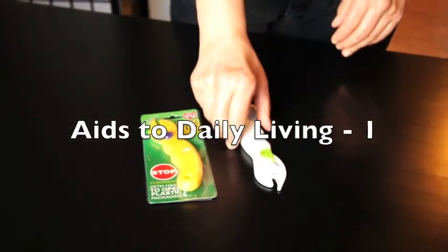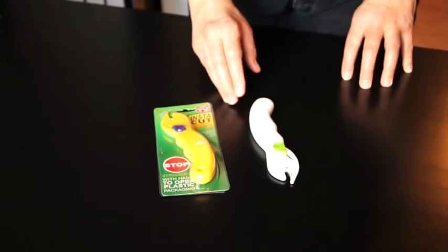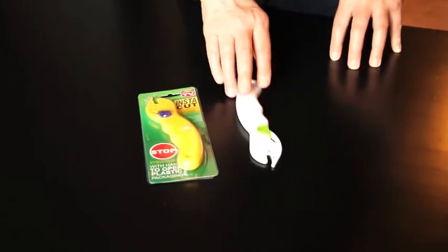Welcome to the series Aids for Daily Living, and this is for people with arthritis and painful joints. Today we're going to be looking at how to get into things and hold things.